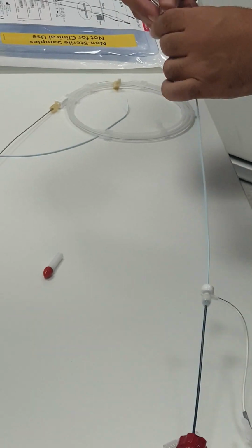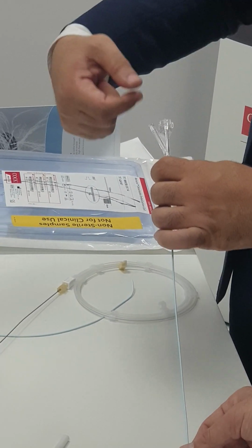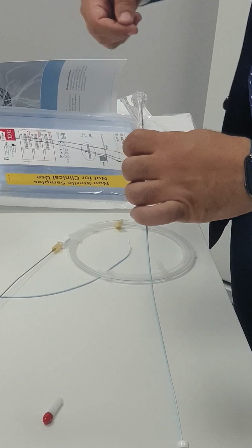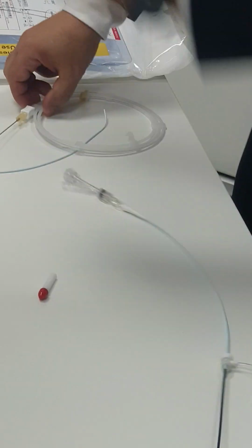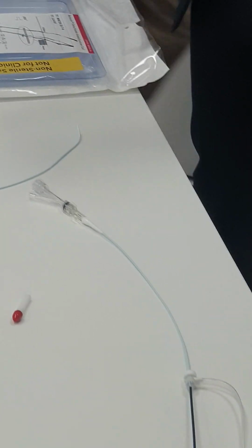We put this Y connector to a port to have a chance to inject contrast media. If you are not happy with the position, you can retrieve it back and reposition it again. So yeah, you can put it and start. This is a great chance for you to know how to do coils.